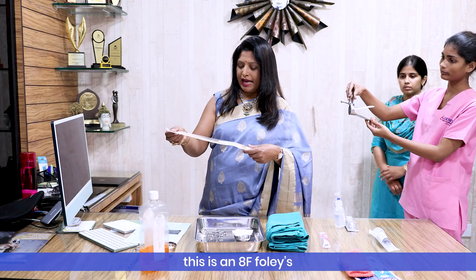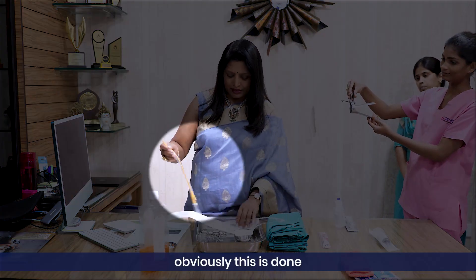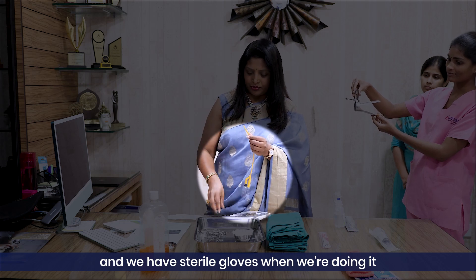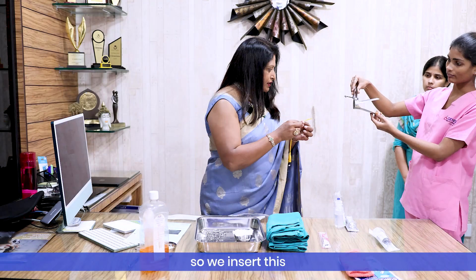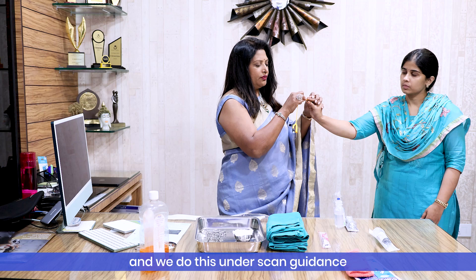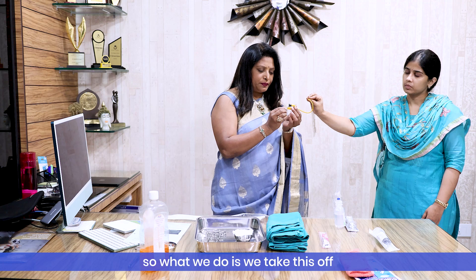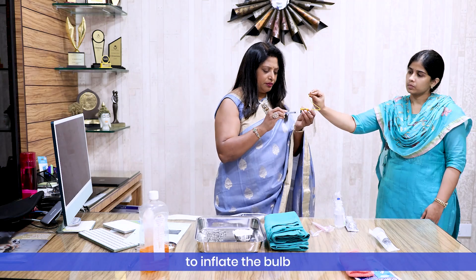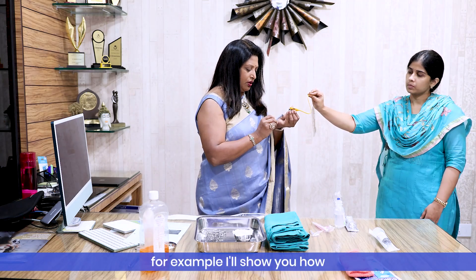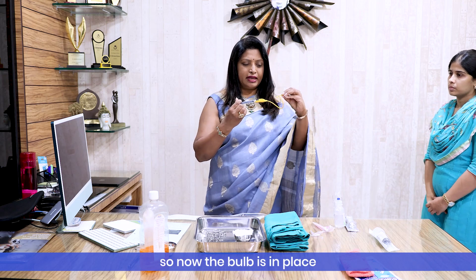Once the cleaning is done, this is an 8 French Foley catheter — very, very tiny, very slim, very flexible, and doesn't hurt. We insert this through the speculum into the cervix under scan guidance. Once it is in, we take a 2 ml syringe and inject some saline to inflate the bulb so that it stays in place. The bulb gets inflated and stays inside the uterus.